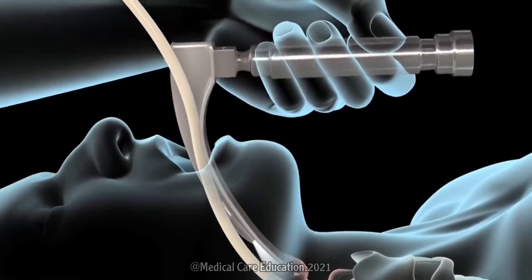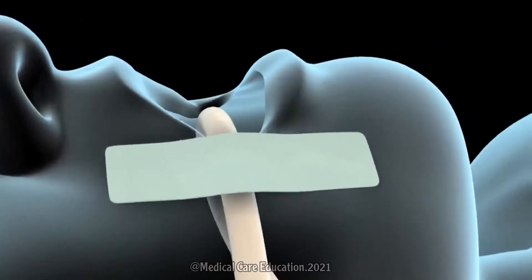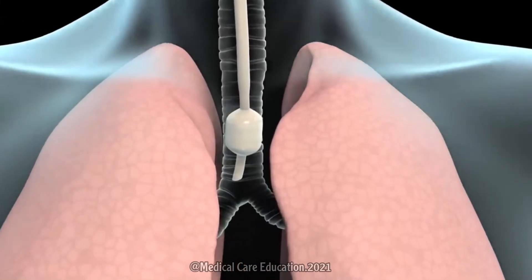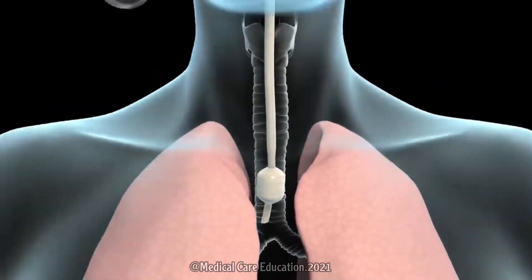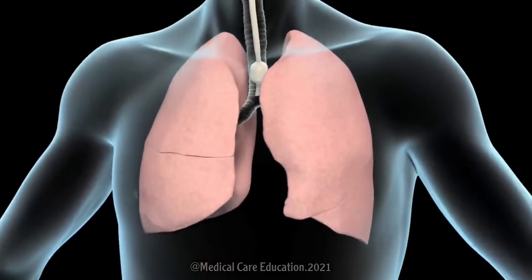They will then remove the laryngoscope and tape the tube to the corner of your mouth to prevent it from being jostled out of position. Your doctor will check to see that the tube is properly positioned in the lower part of the windpipe by inflating your lungs with a special bag and listening for breathing sounds on both sides of your chest.